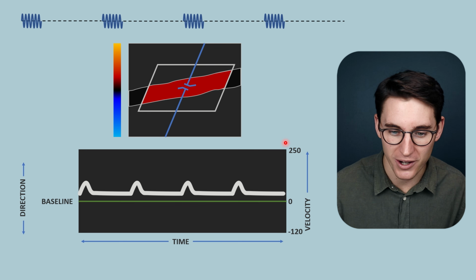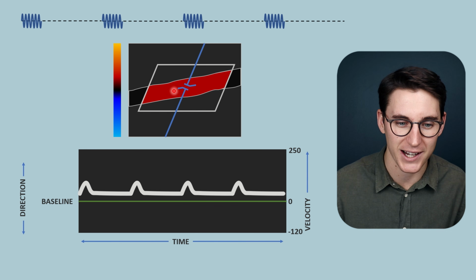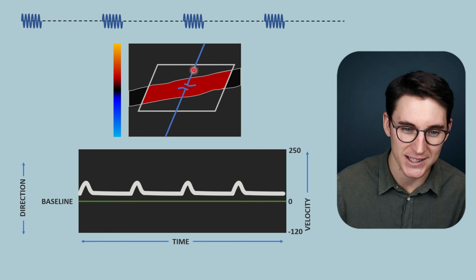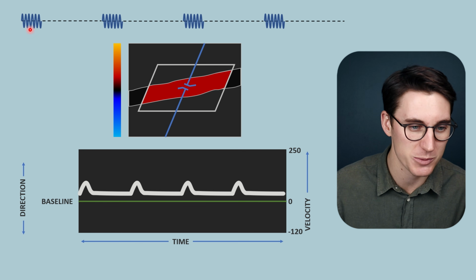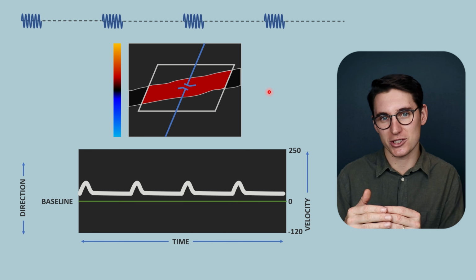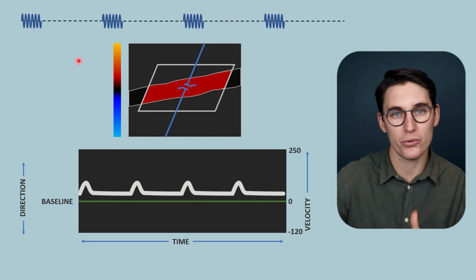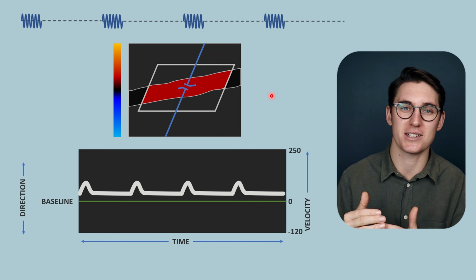Now how do we go about actually calculating the scale here? Well, when we set our A line and set the gate here, what we are doing is inadvertently setting our pulse repetition period, the period of time between the first pulse and the next pulse. We've set a specific depth here, and that depth will allow us to determine how much time we have to wait in this receive time in order for the pulse to come back from our gate, the round trip distance here.